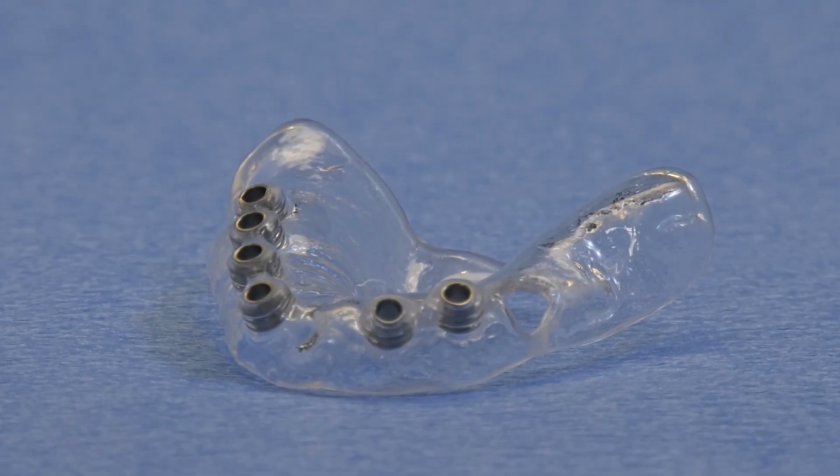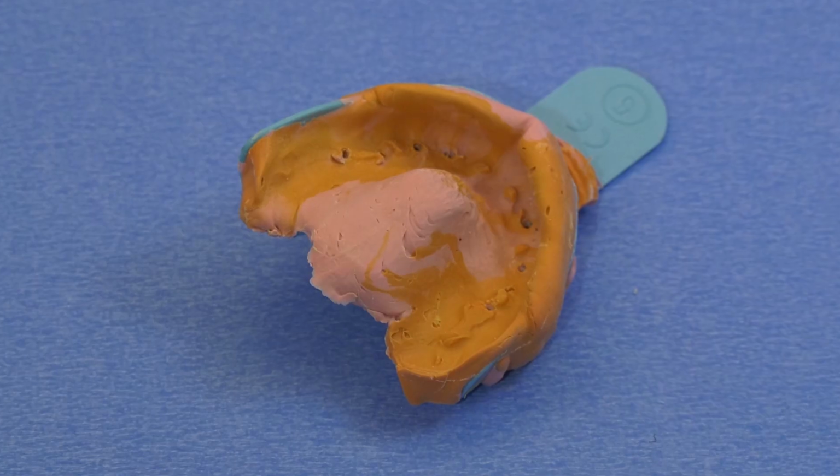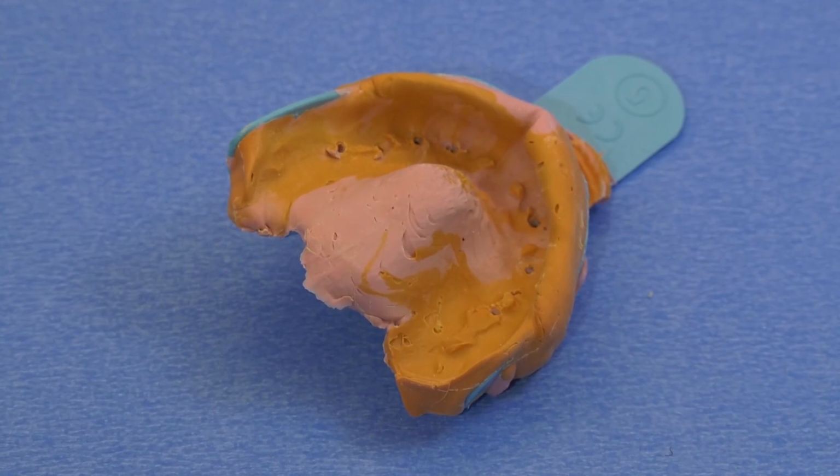That's number one. Number two, we're going to make you a surgical guide stent so that when you place the implants, you can be comfortable placing them where you want to place them. Once you've got the implants in place and you know they're in good bone and they're solid, you're going to take a very good quality impression.